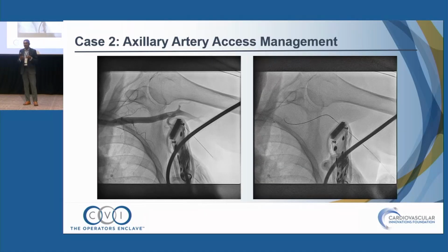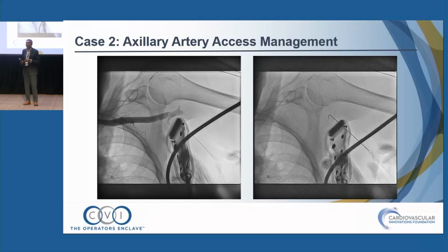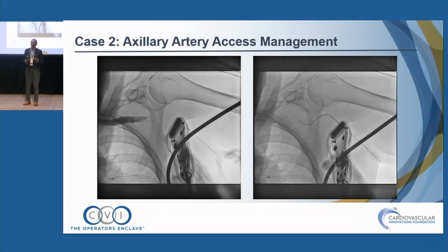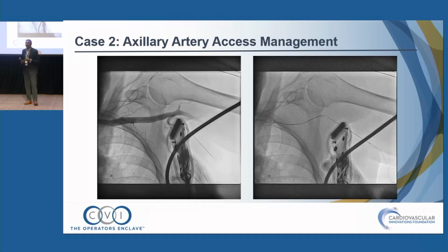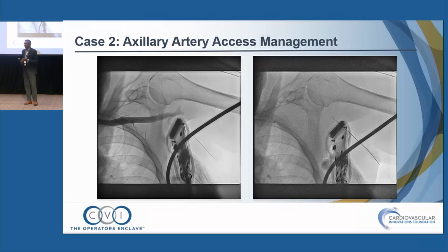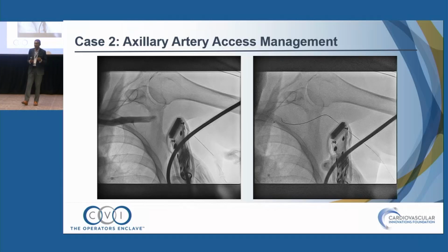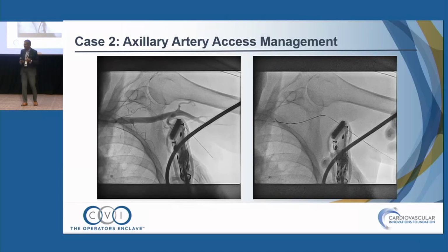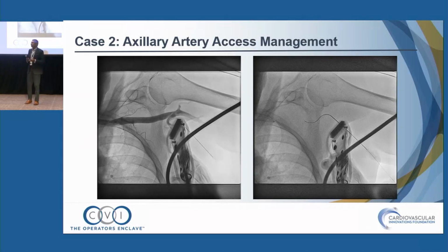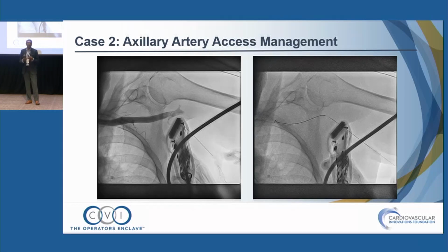And it is not enough to know the 3 segments of the axillary artery and go into the axillary fossa and try to get vascular access. This needs to be carefully planned with CT imaging. I can also tell you that ultrasound live guidance is important, not just to avoid some amounts of calcification, but you can also avoid some parts of the nerve plexus if you do it. And how the patient is going to be placed after, for example, Impella is placed, for long-term or short-term, that actually has a great impact.